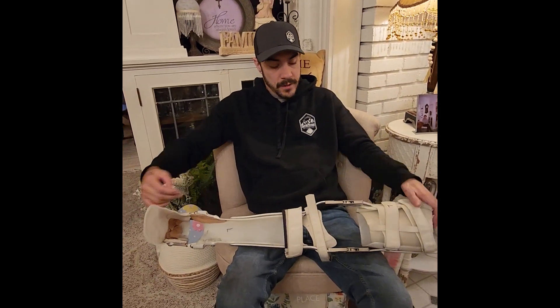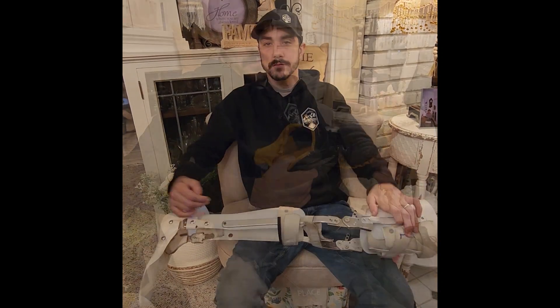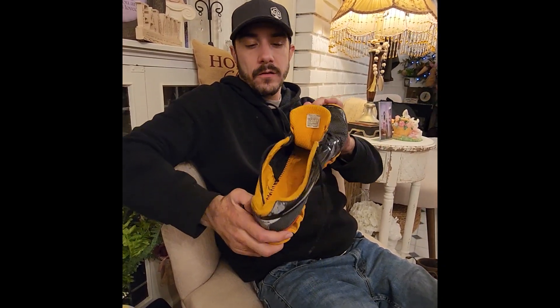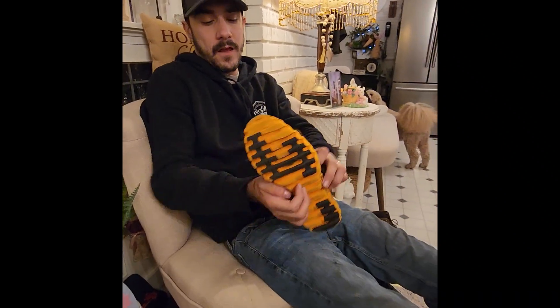It's a simple brace — nothing techy to it, but it does the job. These are the shoes I've been using for the past 10 years as well. The key is I took the insoles out so my foot could go down farther into the shoe with the brace on. I'll show you how I get them on in a second.